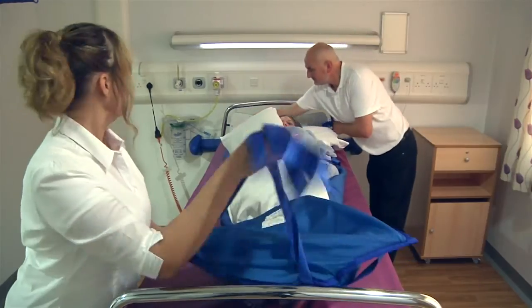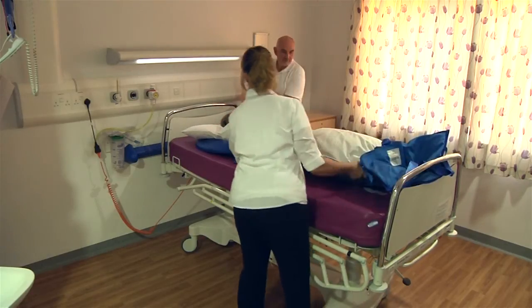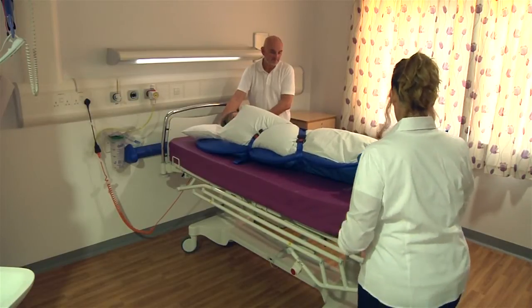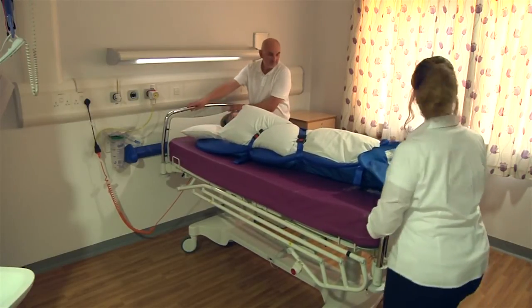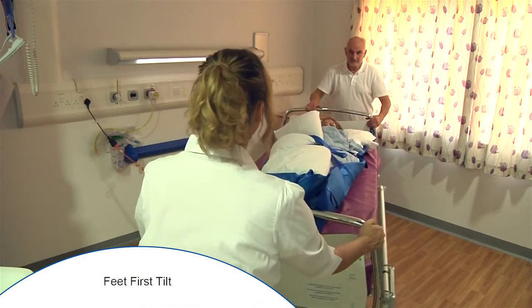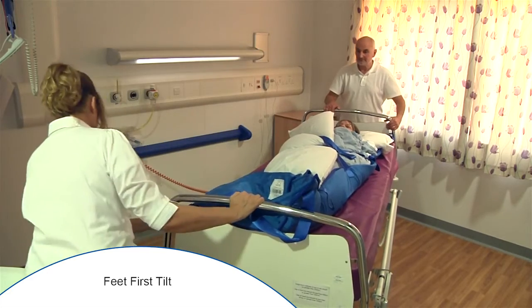Various methods of taking the patient off the bed can be used — please consult your moving and handling department to ascertain the correct method of transfer for your own specific environment. If the type of bed and space allows, the bed can be tilted towards the foot end.